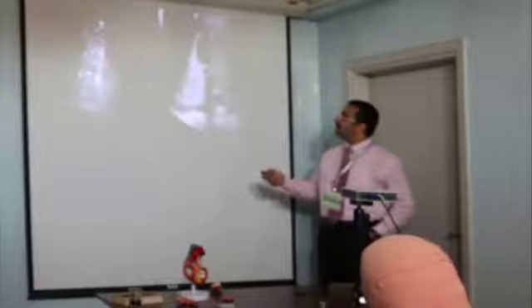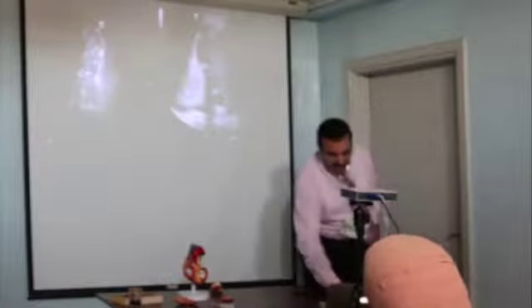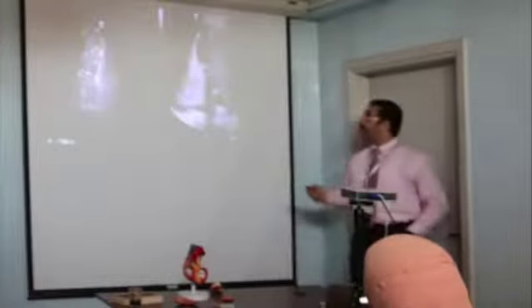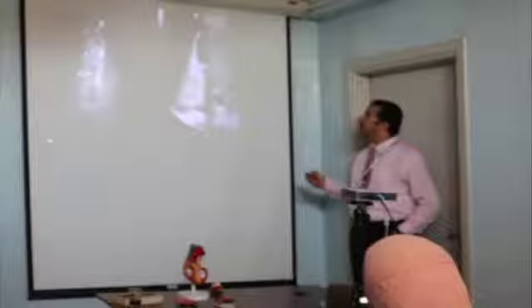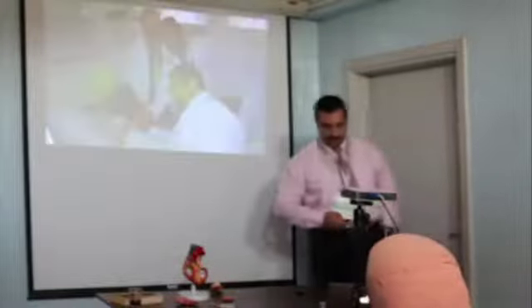So this again is an air bronchogram. Whether it's mobile versus static makes a bit of a difference. This is a static air bronchogram, and this is a dynamic one. I saw the video, but this is still.